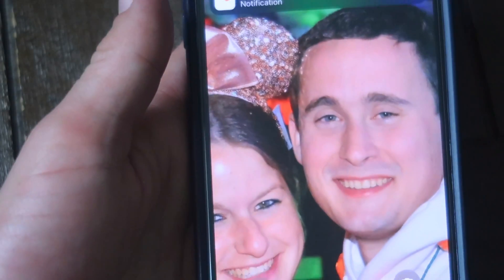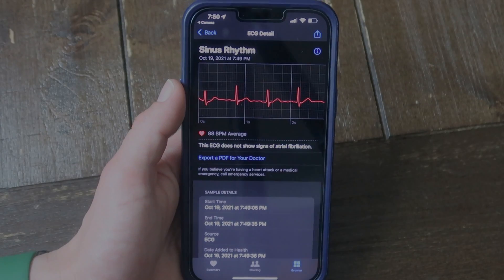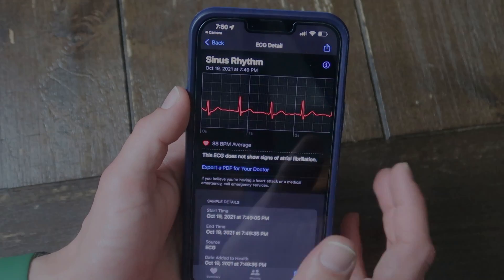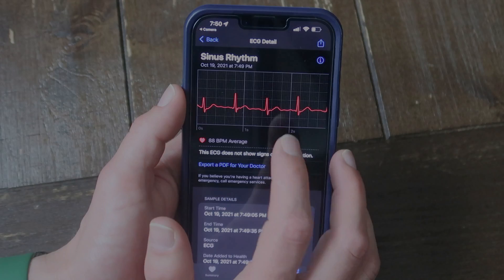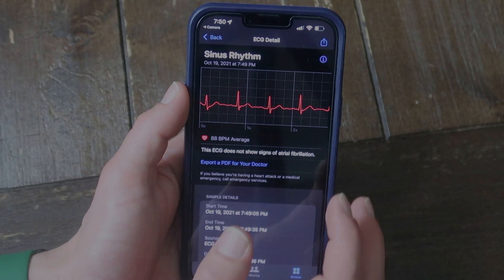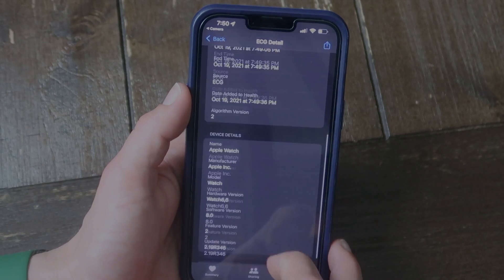Every time you do an ECG, it's going to jump over to your iPhone. Every time that you do an ECG, it is going to show in the Apple Watch health app. So you want to go to your electrocardiograms. I'm going to click on the one from tonight. It shows you the average heart rate, it shows you the picture — whatever that graph means, I'm not a doctor. I had sinus rhythm, which is good. It shows you the start time as well as the manufacturer of the Apple Watch.